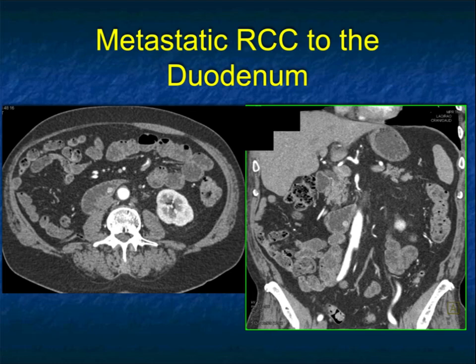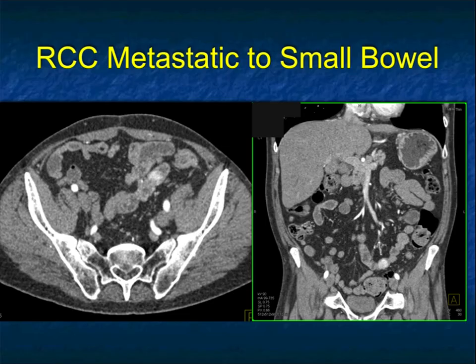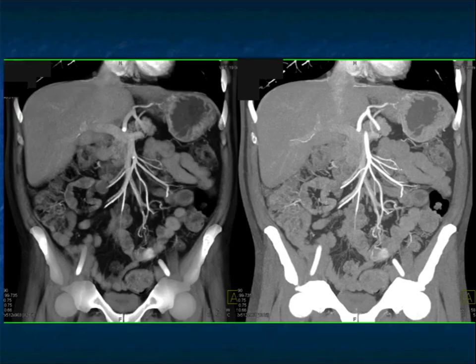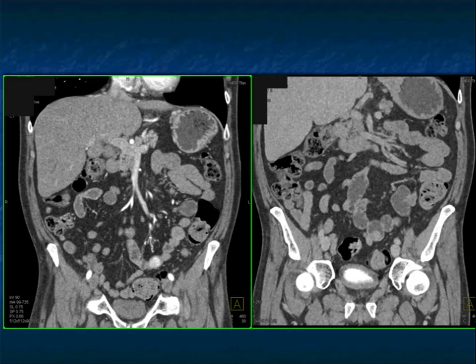Here's a patient with renal cell carcinoma on routine follow-up. There's a one centimeter enhancing lesion in the region of the fourth portion of the duodenum. There's another enhancing lesion in the patient's ileum to the left of midline. In a patient with prior renal cell carcinoma, you have to assume it's more likely metastatic. At times it can be tricky to see, so volume rendering and MIP are shown — because the lesion is vascular, which is very characteristic for renal cell, it really stands out.